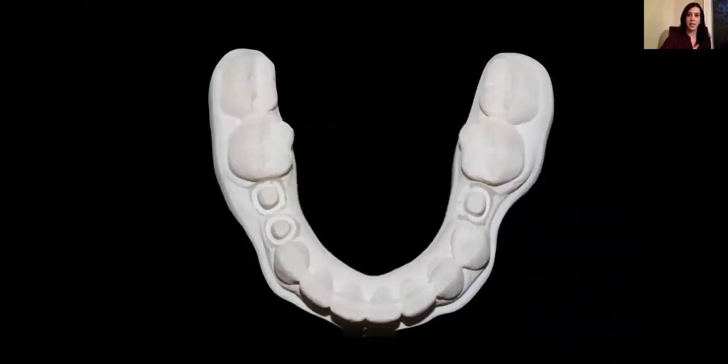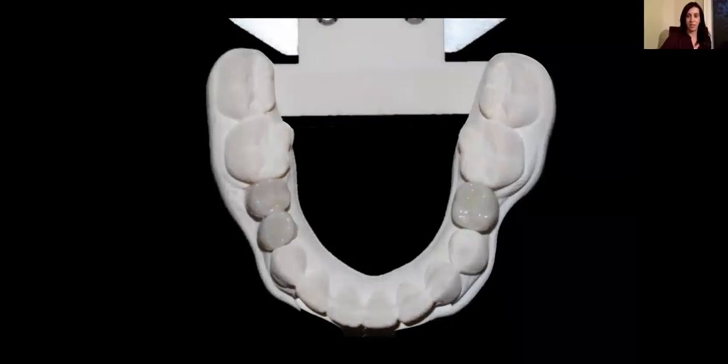So here is a cast of a mandibular cast where we made a digital impression of 3 implants that you can see, one in the 3-5 site and 2 in the posterior right mandible. And what you're looking at here is a cast of the abutments, the custom abutments that were made, or a replica of the abutments, and here are the final crowns.